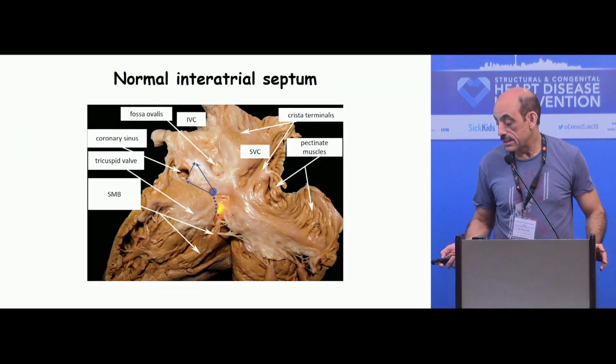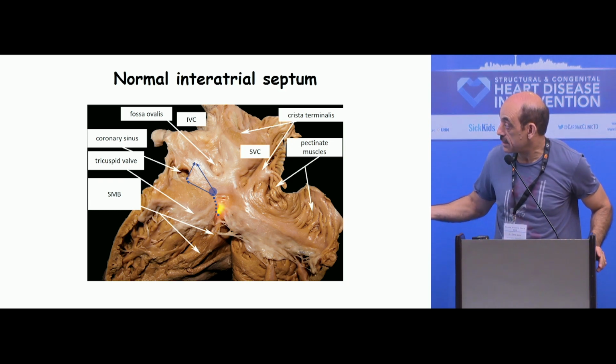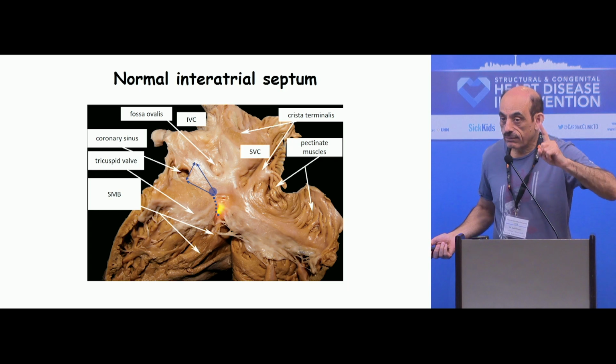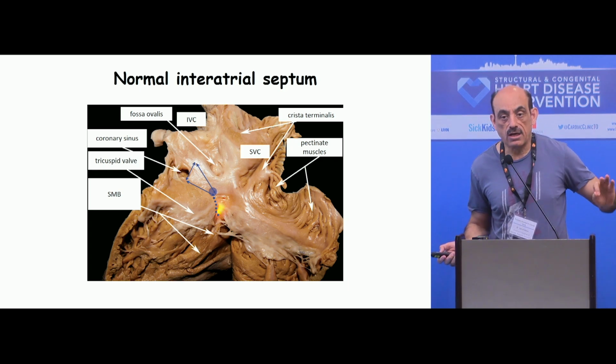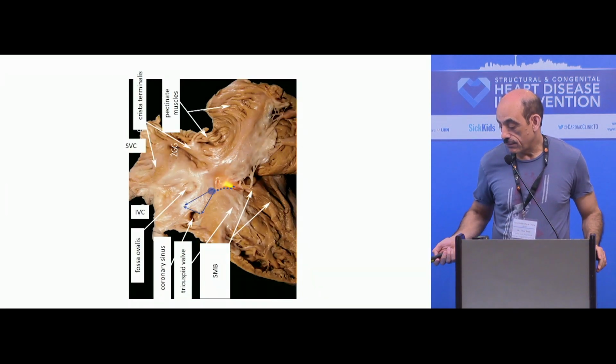Okay, and here inside, if this is the fossa ovalis, this is the triangle of Koch. This is how the AV node goes towards the anteroseptal commissure of the tricuspid valve, and dips down. And that's why, if you have IVC rim absence and you put a device big enough that it will wedge there, you may have rhythm issues in those patients. So AV block, very, very uncommon, but it will happen in those patients. This is anatomically.